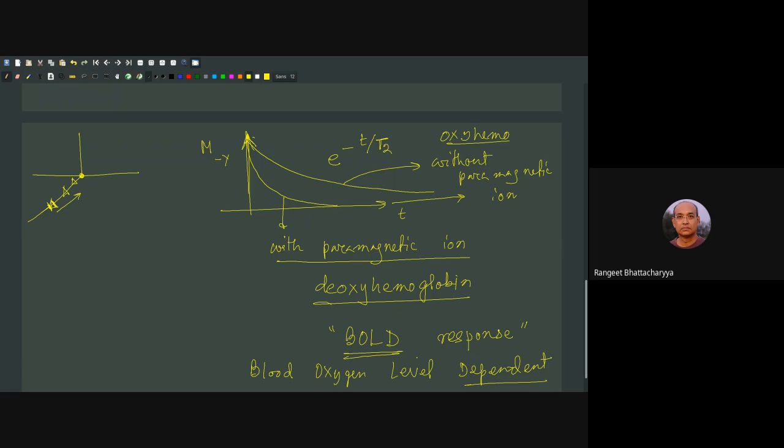Typically, when they try to detect, for example, a brain tumor or any irregularity in the brain, they just put the person in and record an image of a slice of the brain, and during that time which part of the brain is active, whether the patient is having some activity in some part of the brain, nobody cares. So you can say the intensity distribution in that image is actually indicative of nothing.